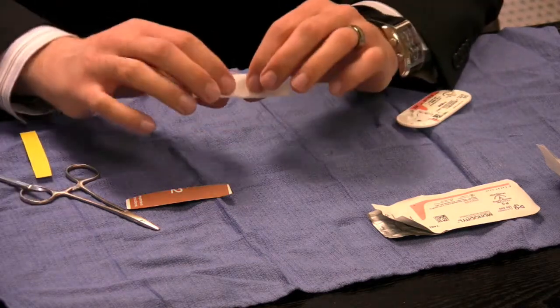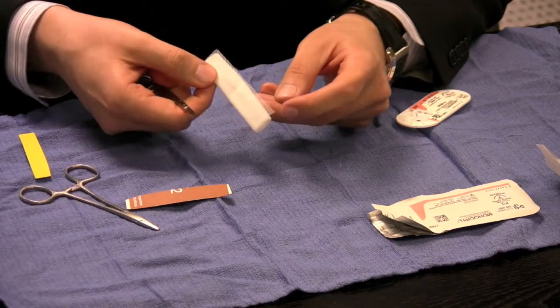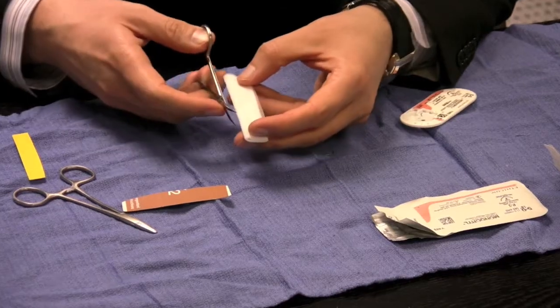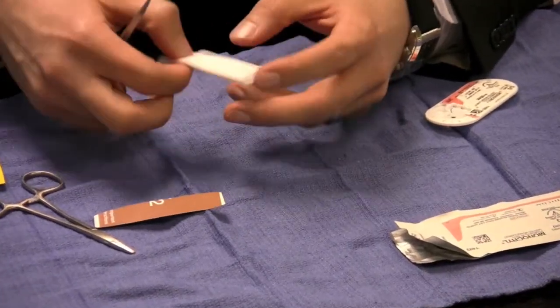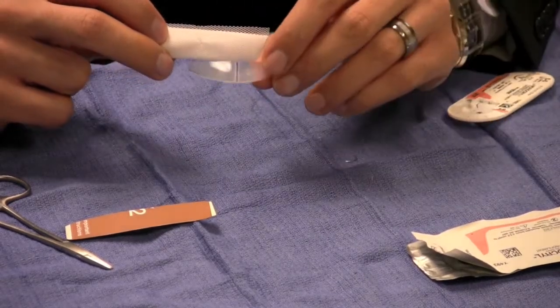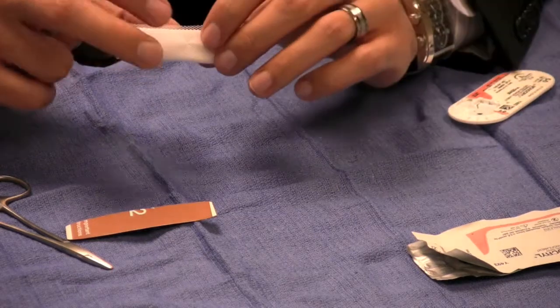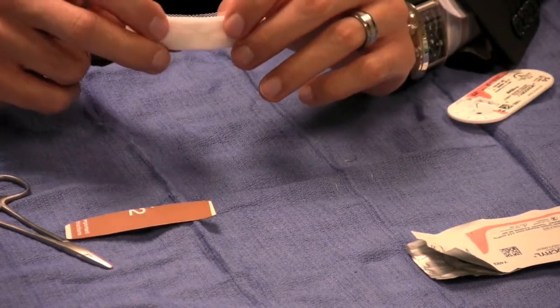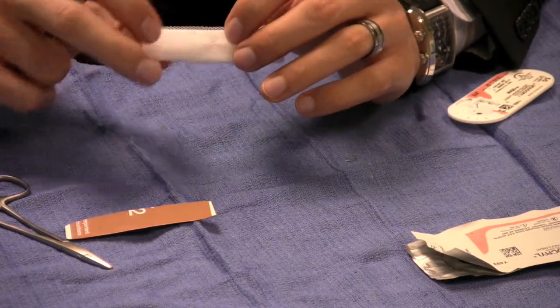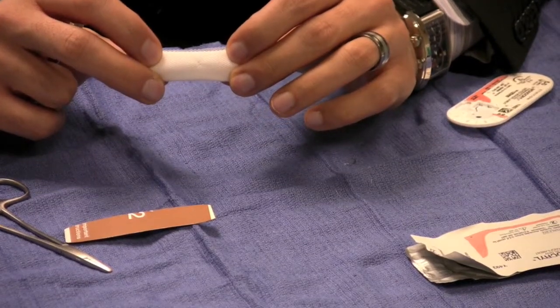Now, we'll cut the suture, and this is basically the chin implant. Again, during the actual surgery, I will cut this into the shape that I need. So I'll take a large pair of scissors and trim this into a small oval shape, something that basically resembles more of this contour. But the advantage of the Mersilene mesh is that it's soft, it's pliable, it sits right on the patient's bone, on their chin, and it conforms nicely. Once it's in place, it does not shift. It's almost impossible to make this shift.